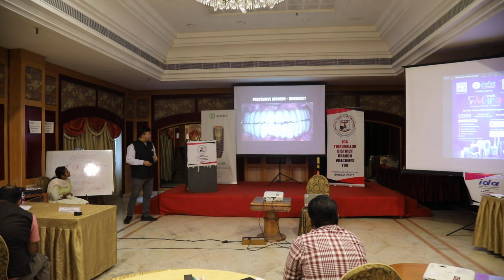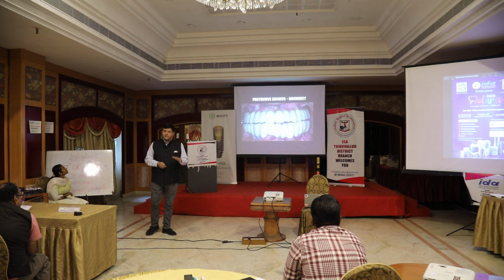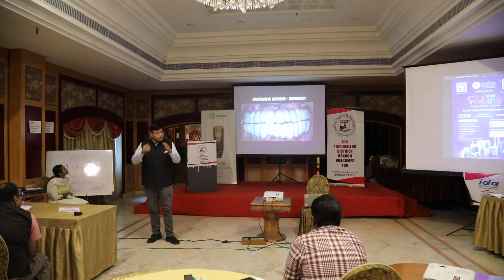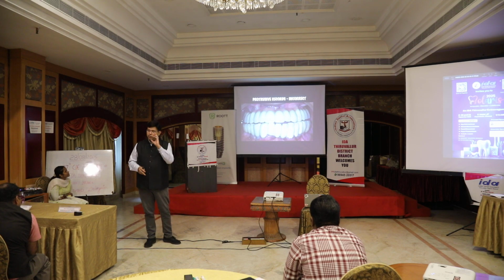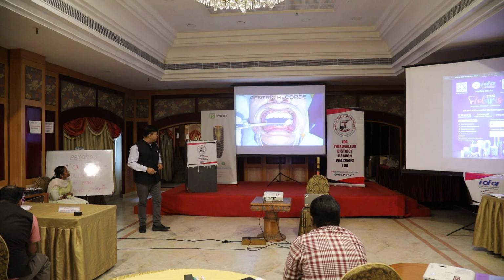Then I ask the patient to do a protrusive. What do I see in this protrusive? What is coming in contact? Only one central incisor. Will this prosthesis fail? For sure, 100% this prosthesis is going to fail. This will not fail only if the patient is on liquid diets. Otherwise, this prosthesis is positively going to fail.